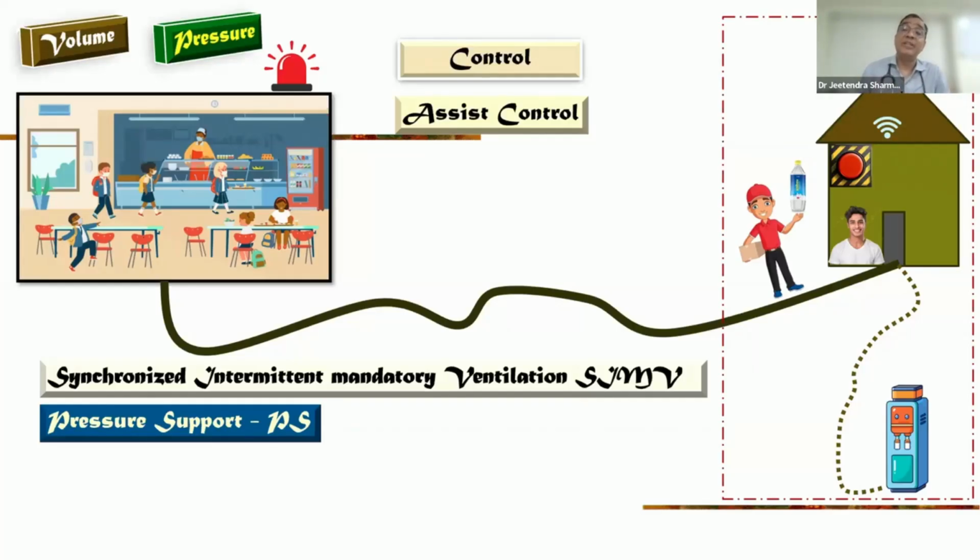Now one more advancement in triggering, as technology is advancing. After Wi-Fi, what new thing happens? Previously you had to go to the device physically. Later on, you have mobile with Wi-Fi enabled. Now, next generation, they use Alexa, Siri. What you call voice-based command. So this is the voice-based command.